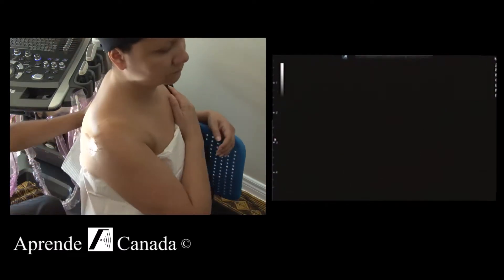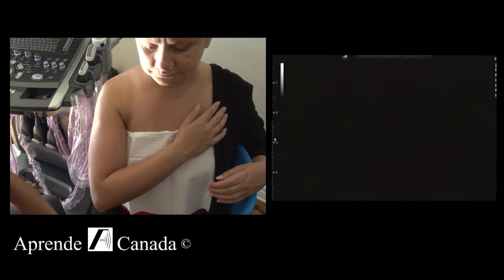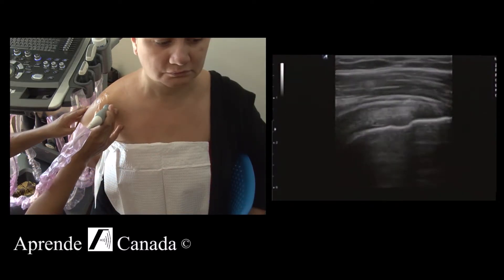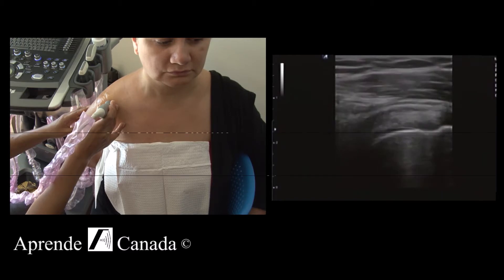Again, facing the camera — perfect. I'm going to ask the patient to do an internal rotation, so bring her arm. We can also slide a little higher and see.